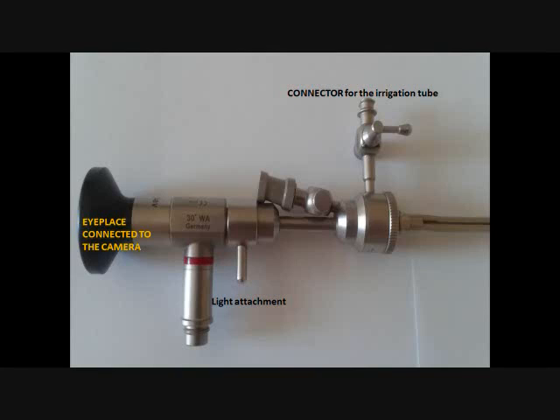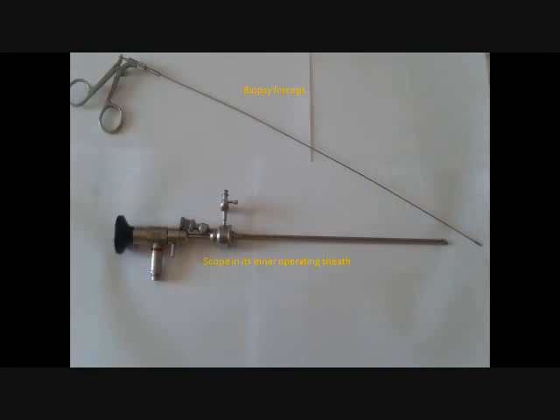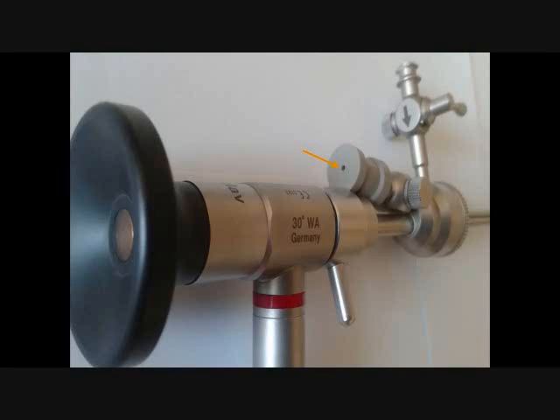See, there is a connector for the irrigation tube, for the light, and for the camera. And after that, we'll be able to insert the operating instruments inside the working channel. We have the example of an instrument here, a biopsy forceps. And that's the little hole where we'll be inserting the instruments inside the channel. See the arrow's direction on the irrigation connector. The arrow goes down, indicating the direction of the fluid's flow. So here, the fluid is instilled, so that's an irrigation tube connector.